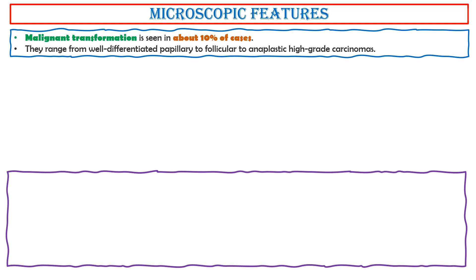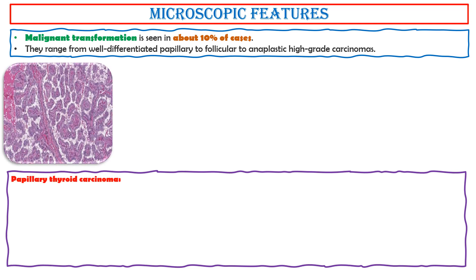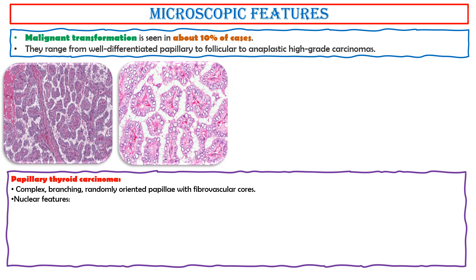Malignant transformation is seen in about 10% of cases. They range from well-differentiated papillary to follicular to anaplastic high-grade carcinomas. This photo shows complex branching, randomly-oriented papillae with fibrovascular cores. Nuclear features include changes of nuclear size and shape, including nuclear enlargement, elongation, and overlapping.